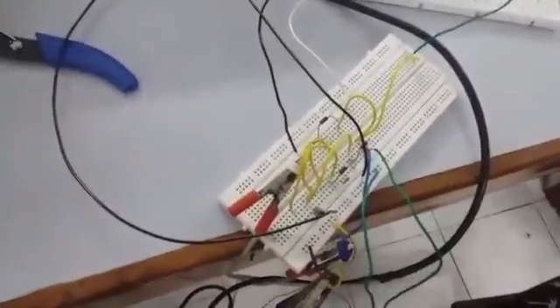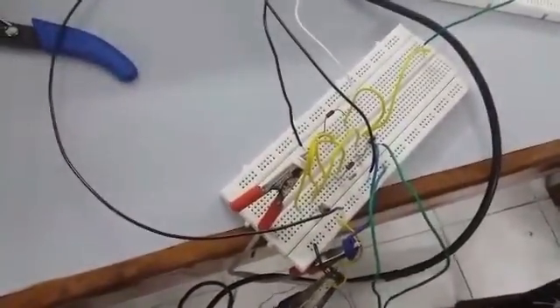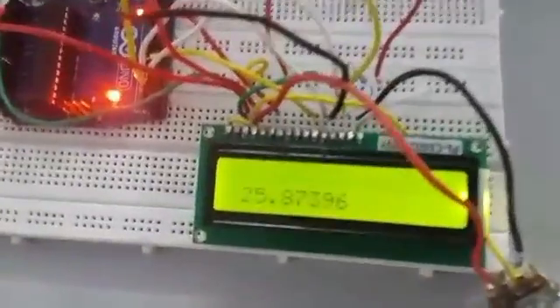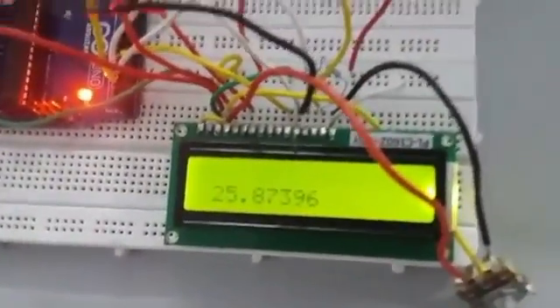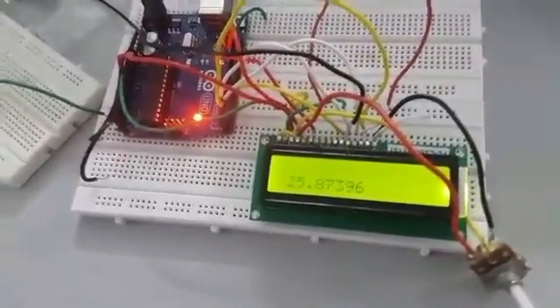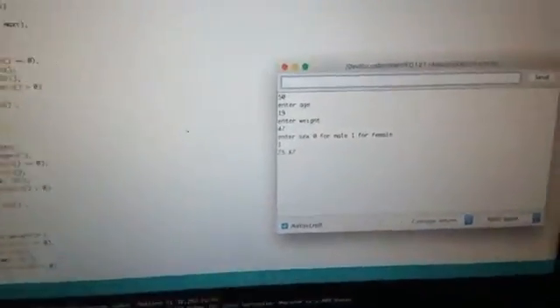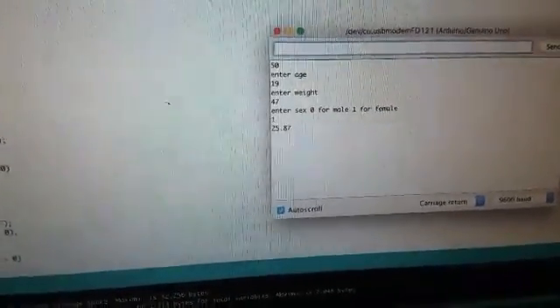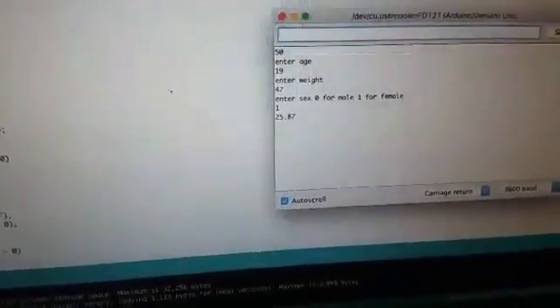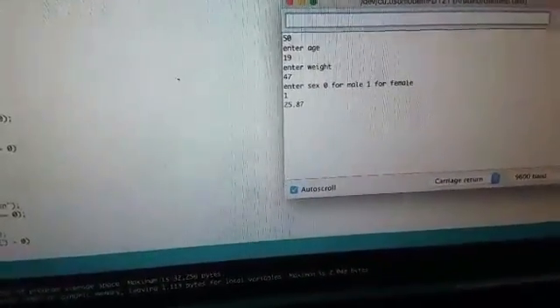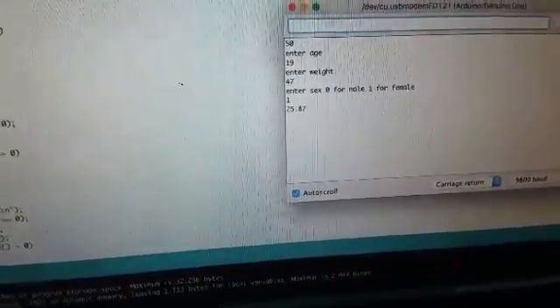Finally we have given the peak to peak voltage to the Arduino and printed on the LCD. As you can see 25.873 is our fat percent of the body. This is the Arduino code. These inputs we have to give: age, weight, and sex 0 or 1 for male or female.